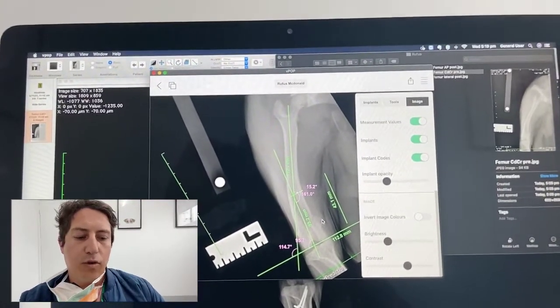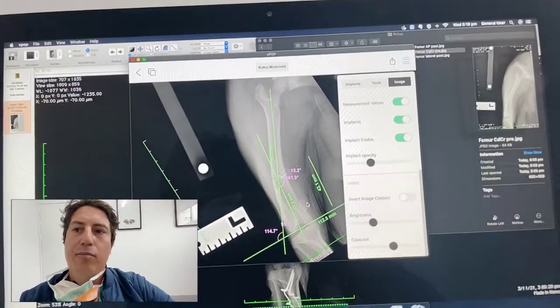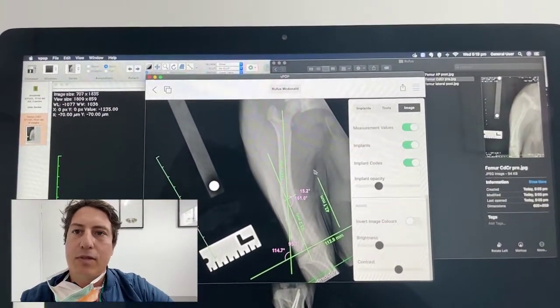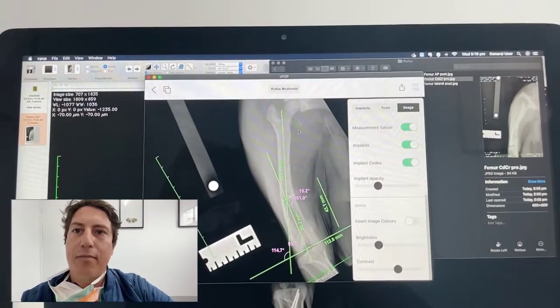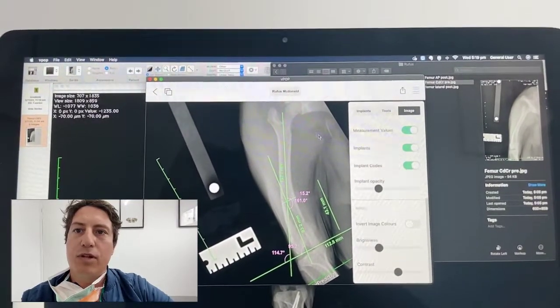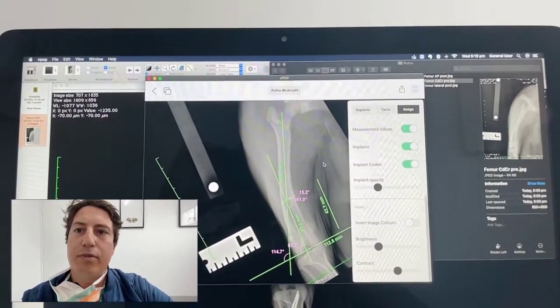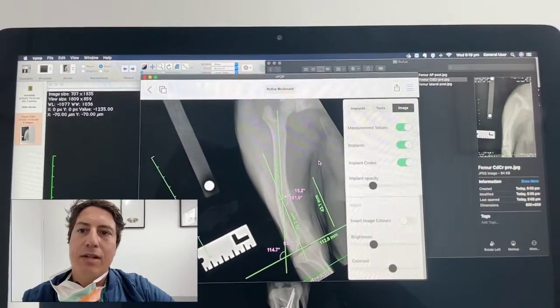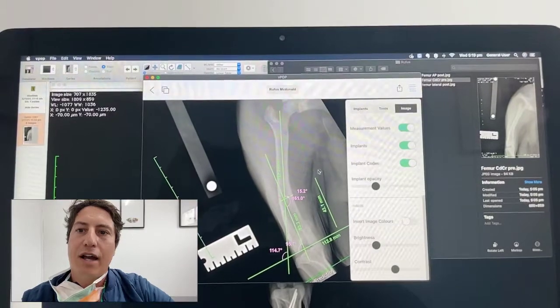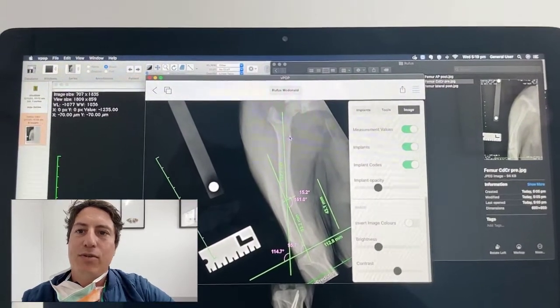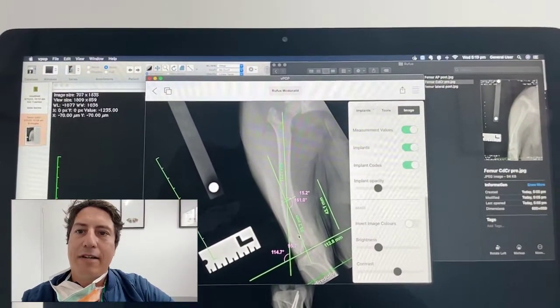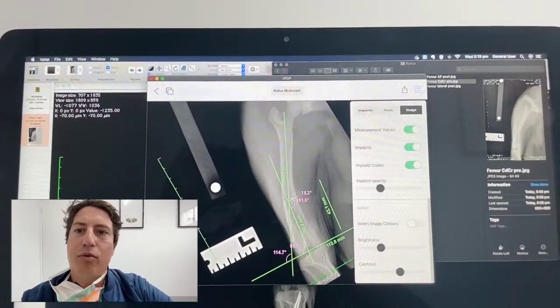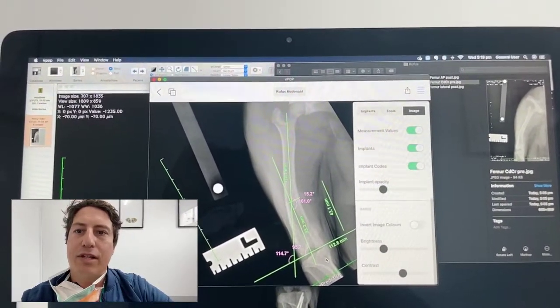I just wanted to kind of walk through the planning of this case using this awesome program VPOP Pro, which is what I do a lot of my orthopaedic planning on, and just wanted to highlight this issue of distal femoral varus in these cases — why that's important and how we actually correct it.